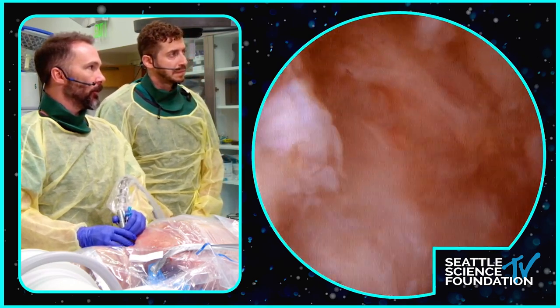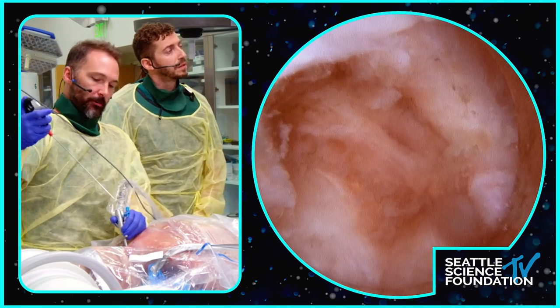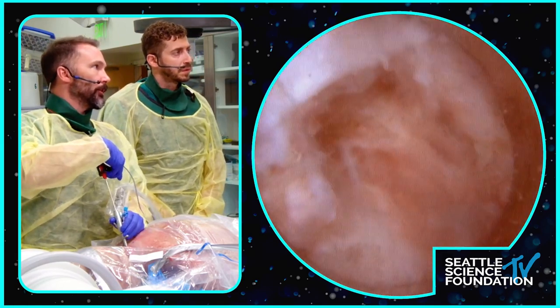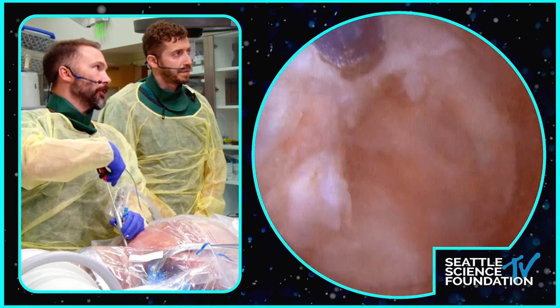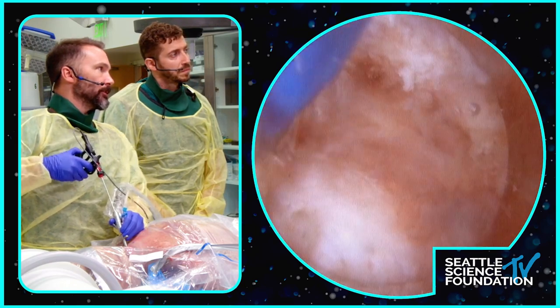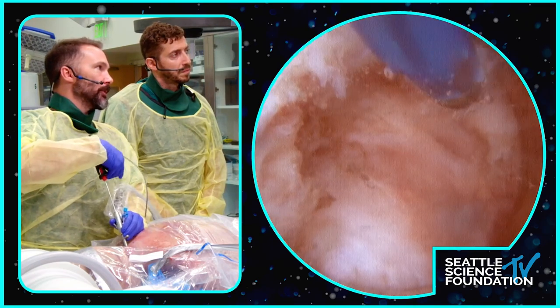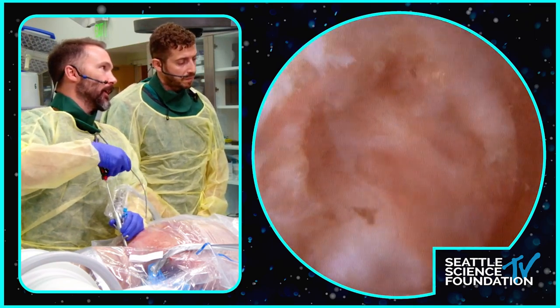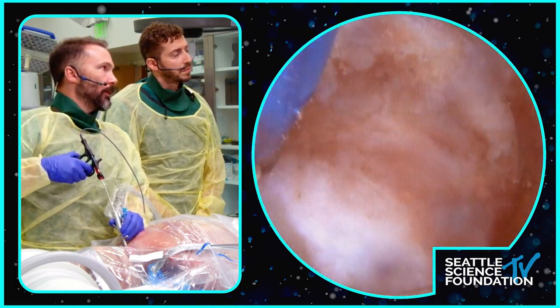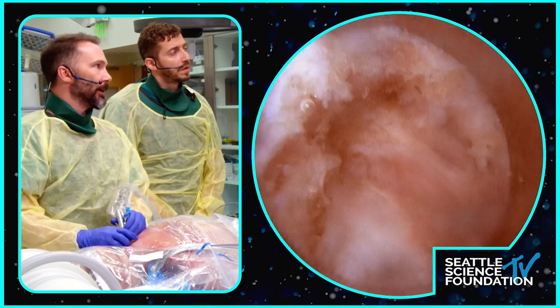I can see some bony landmarks and I start to clean that up. There's always going to be a little bit of muscle creep, a little soft tissue left. I'll clear that off with cautery, using a little bit of scissors, the pituitary is nice. The goal here is not to expose everything — I'm not going to operate on everything I'm seeing. My goal is to make myself comfortable that I've exposed enough bony anatomy to know where I am and use those bony landmarks as my guide.